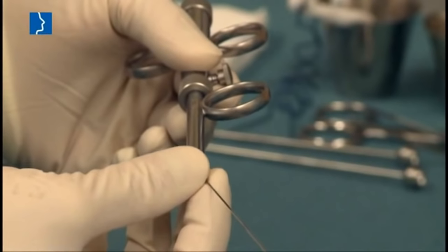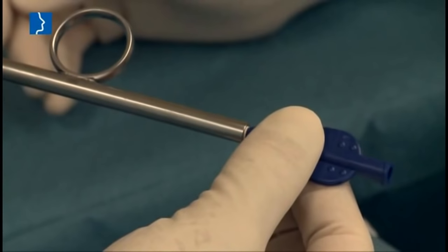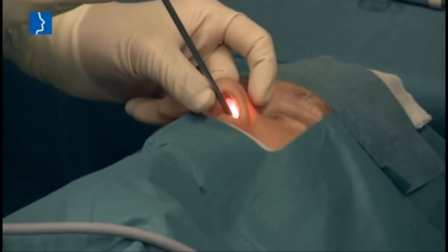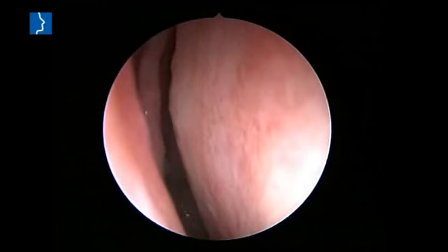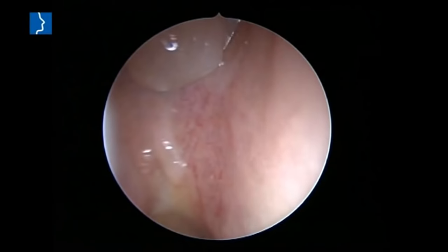Insert the balloon catheter into the insertion instrument, making sure that the blue arrow at the end sits tight. Insert the endoscopic camera into the nose as with a normal nose inspection and localize the tubal ostium of the opposite side. Then insert the insertion instrument with the balloon catheter on the side to be treated, placing it within the ostium of the eustachian tube.